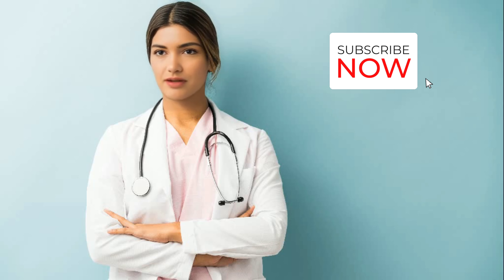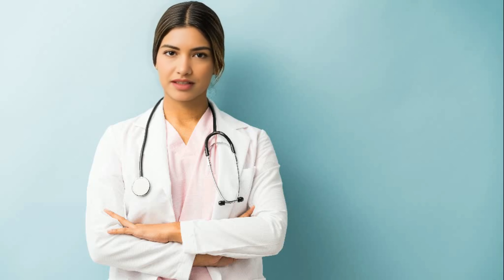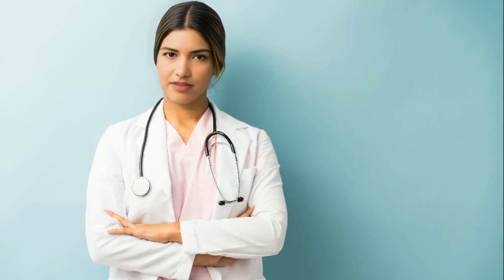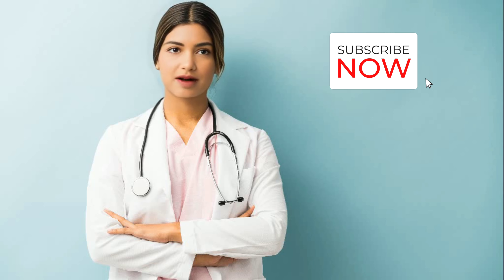Whether you're a dental professional looking to refine your skills, or someone planning a visit to the dentist, this video has something for you. So, let's get started and learn how we can restore those teeth with composite fillings, and keep that beautiful smile bright.